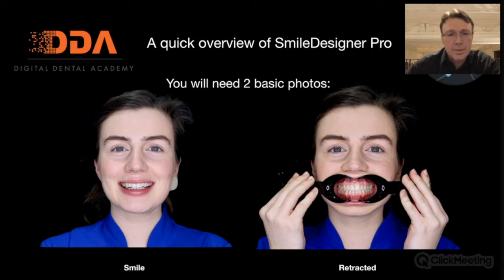These 2 photos are the basics that you will need. You can actually just do it with the smile alone, but then you won't be able to analyze the gum heights and the proper angles of the teeth. But if that is all you need, you can just do it on a smile photo as well.